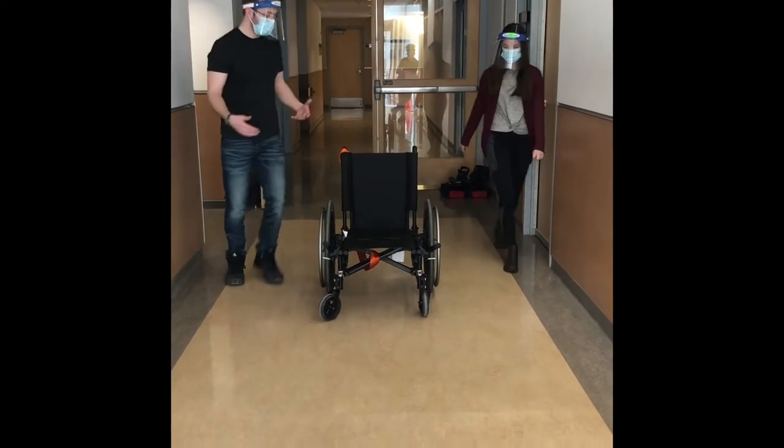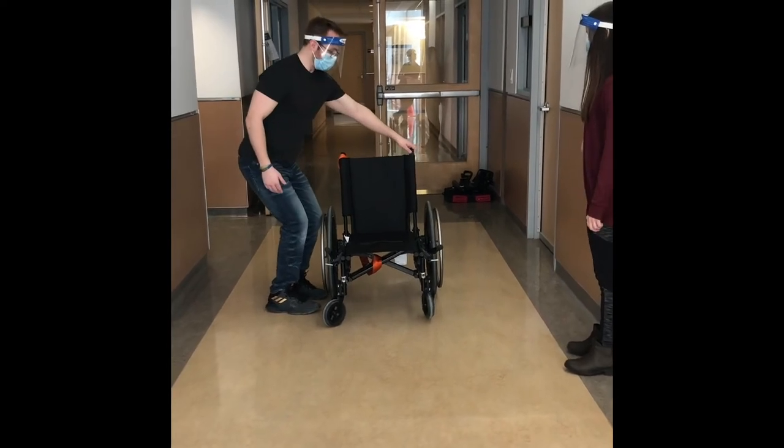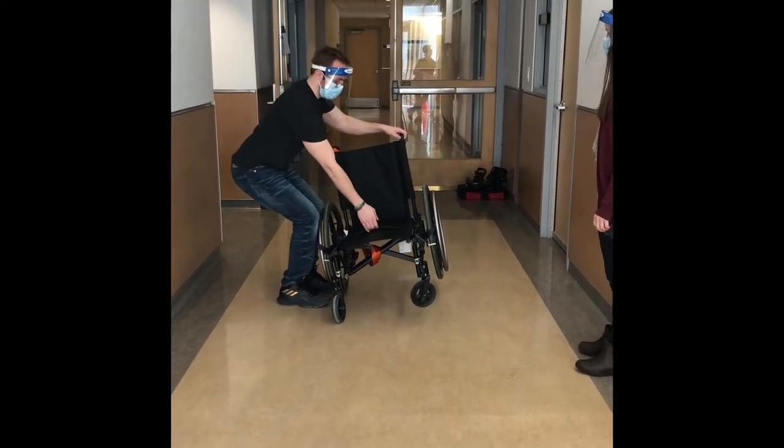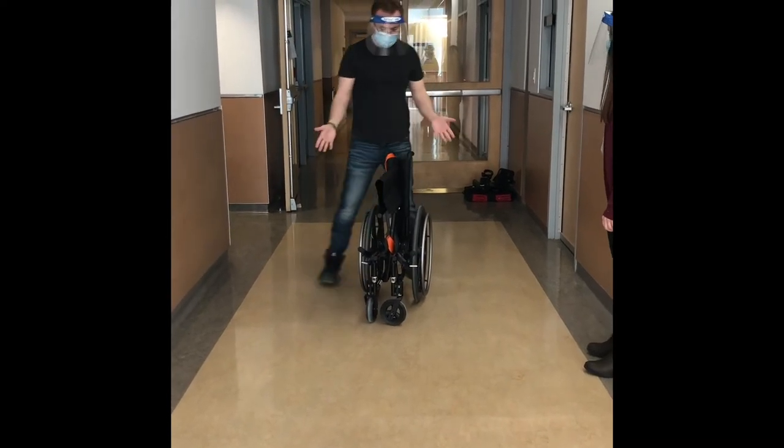Next up, we're going to actually fold the chair. To fold the chair, let gravity do some work for us. We're going to lift it up a little bit like this, grab this middle part here, and pull it up. Set it right down — there you go. Fold the chair, nice and easy.